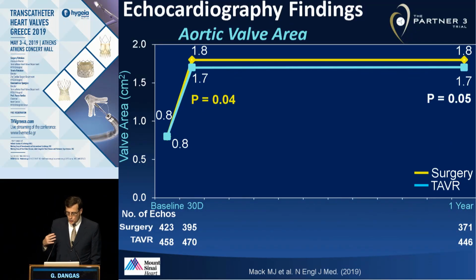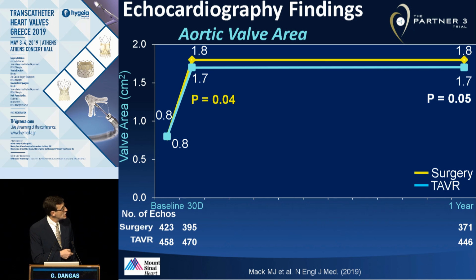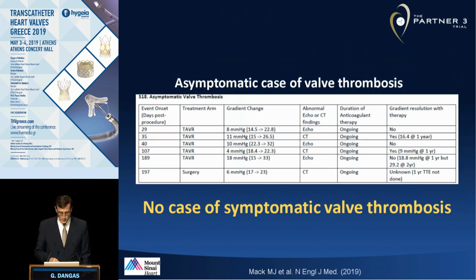The way this may go, and what may be associated, is now a question of what can happen in the low-risk population. And we're going to see more data later in the year at TCT about the low-risk studies, dedicated CTA imaging sub-study. I'm just going to show this finding that we have from the ACC presentations this year that indicate that the valve area seems to be, at this point, with surgery versus TAVR, very, very similar. So I don't suspect we're going to have major differences there. We're going to see about that population later on.